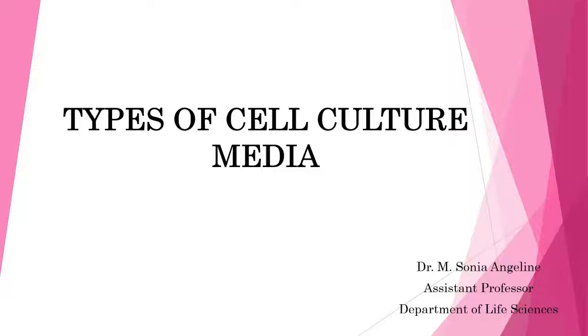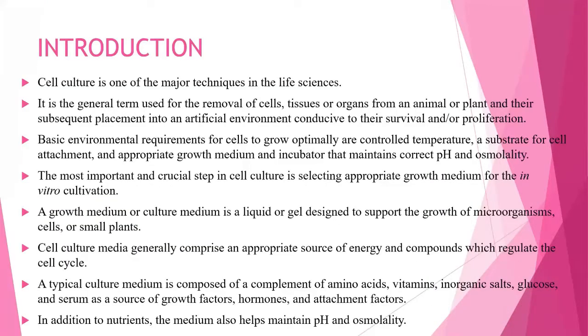About the different types of cell culture media. So, to give a small introduction about cell culture media: when you want to culture cells, you have to have basic requirements like the media, then the sterile conditions of maintaining the CO2 incubator, and also the equipment.